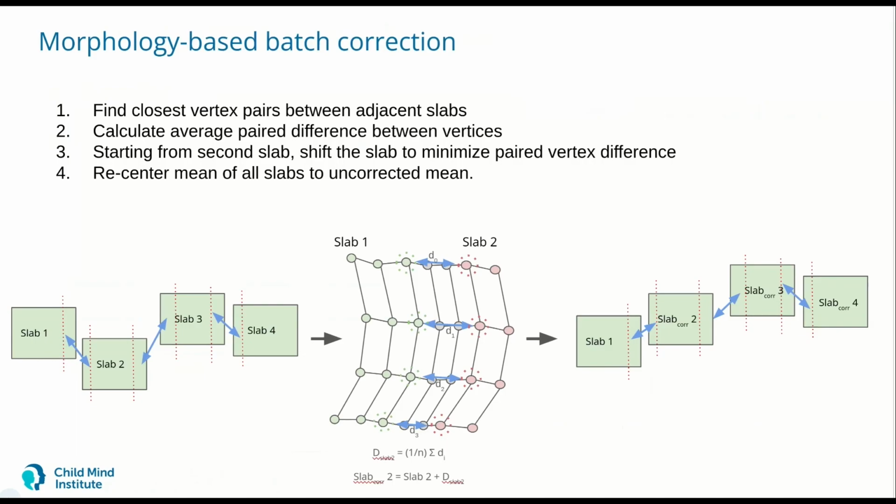So this uses a cortical surface, like a mesh extracted from the T1 MRI of the donor. The idea is that on this mesh, for adjacent slabs, we can find the closest pairs of vertices, and then calculate the average pair difference in intensities measured at those vertices, and then simply use those average differences in pixel intensity between the two slabs to then correct all of the slabs. So it's a very simple approach, but it seems to be fairly effective, as I'll hopefully convince you of in a second. So the idea is you'd maybe have your batches, your tissue slabs, start with this sort of distribution, and then at the end they have a corrected distribution that looks like something else.